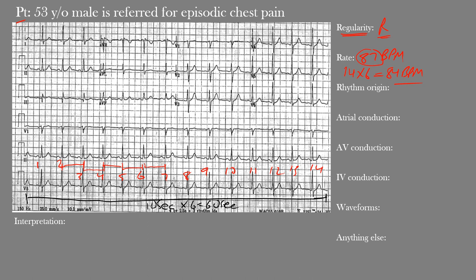Another method works well for regular rhythms: find a complex that falls on a thick line and count the thick lines to the next R wave. Here there are just over 3 thick lines. Do 300 divided by 3 equals 100, and 300 divided by 4 equals 75. Since it's between 3 and 4 thick lines, the rate falls between 75 and 100 — consistent with the actual 87 beats per minute.